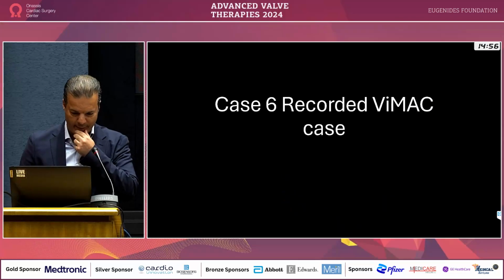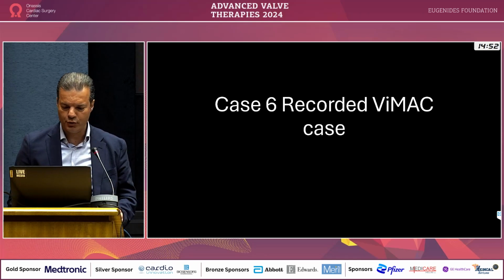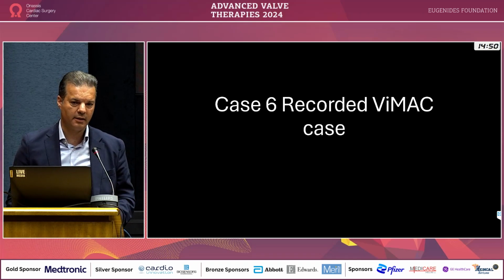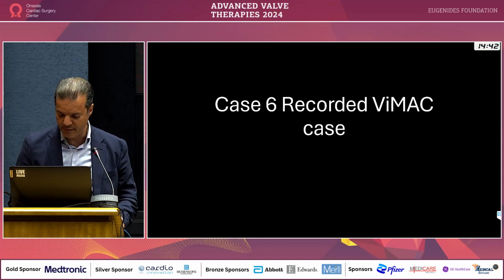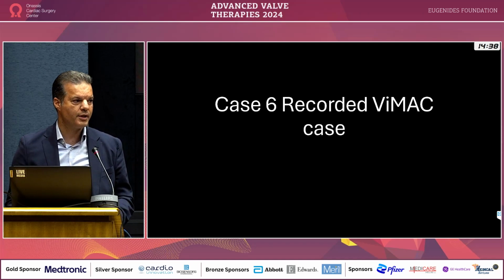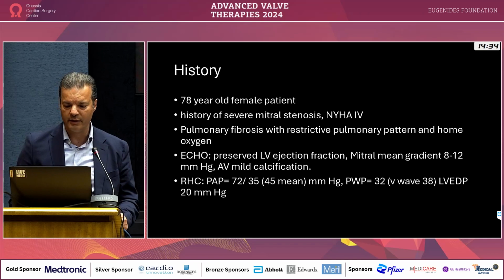Asked by Yannis to present a case with valving MAC, I had one case that we did. MAC is difficult for surgeons, it's difficult for interventionalists, TEER is difficult with MAC, TMVR is difficult with MAC. Valving MAC is used with balloon expandable technologies, but doesn't have the same results as valve-in-valve or valve-in-ring. And there are anchoring factors. The most important limitation usually is that MAC cases have narrow LVOTs.